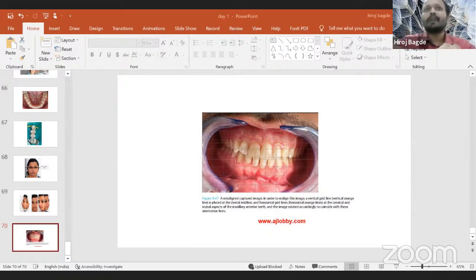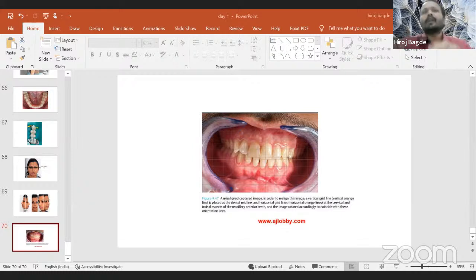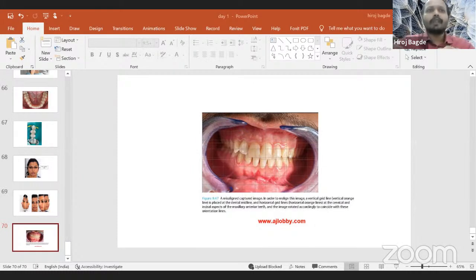So we will have changes in fill light. If I increase the light, it will again shift to the right — I don't want the fill light to be too much. If you go with the highlights, there is again a shift. If you go with the shadows, there is a shift to the left. We'll just play around with this. My uniformity has arrived — can you see the uniformity? Earlier it was shifted to one side; later after crop it shifted further; now there is uniformity of what data has been available.